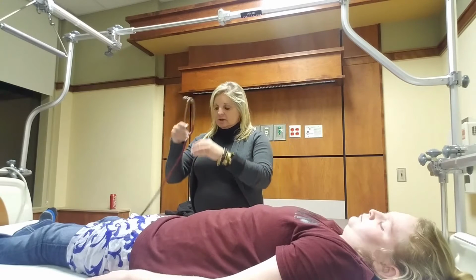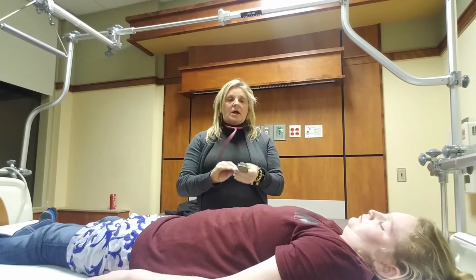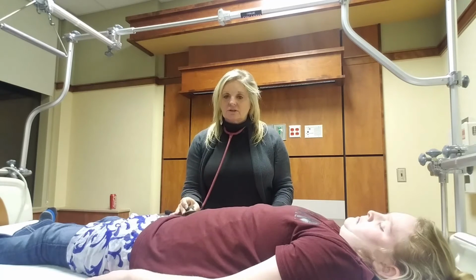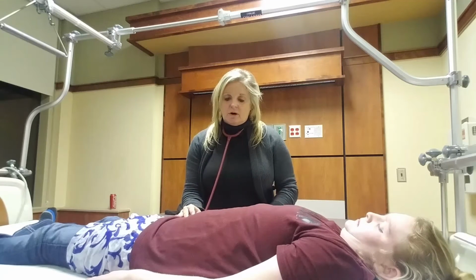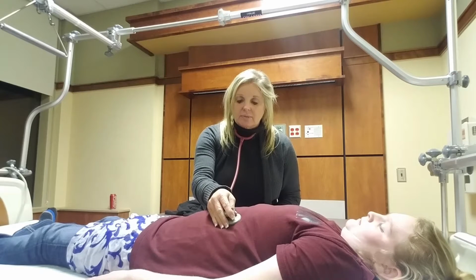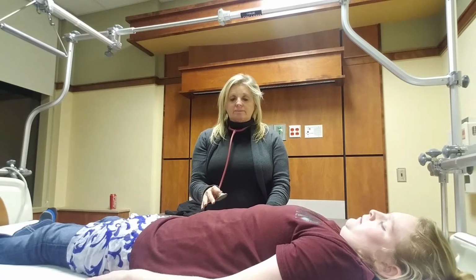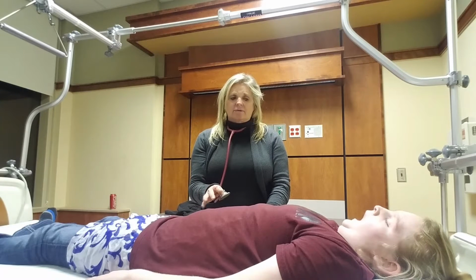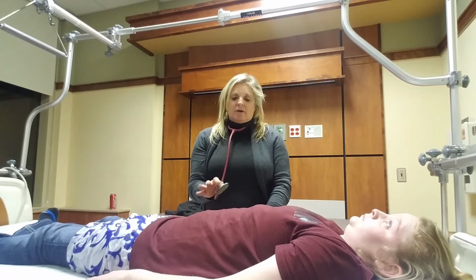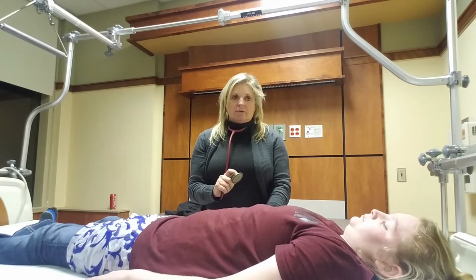Okay, next we're going to move on to auscultation. When we auscultate, we're going to use the diaphragm of the stethoscope. We're going to start at the ileocecal junction, and that's normally where the bowel sounds are more prominent. So we're going to start there, and we're going to move up to the right upper quadrant, to the left upper quadrant, and the left lower quadrant. As we're doing this, we're going to listen, and the normal sound should be about 5 to 35 per minute. If they were absent, then we would listen for a full 5 minutes before we could make the determination that they were not there.